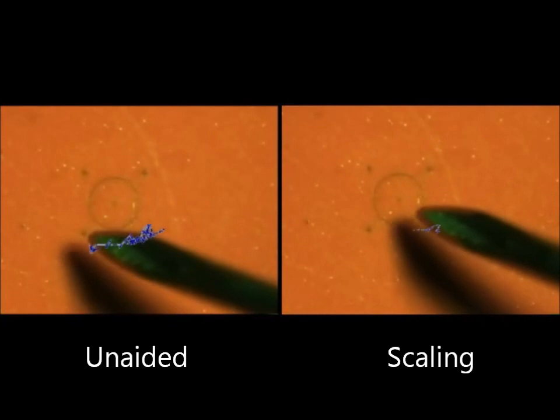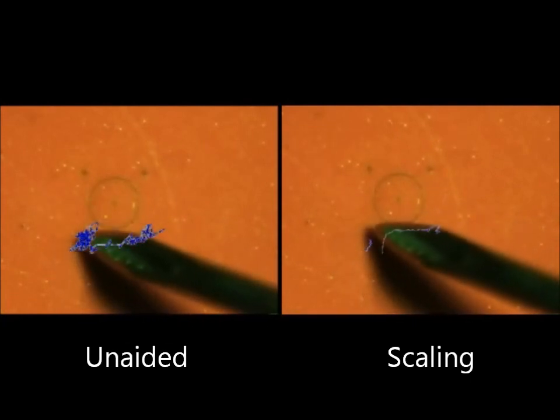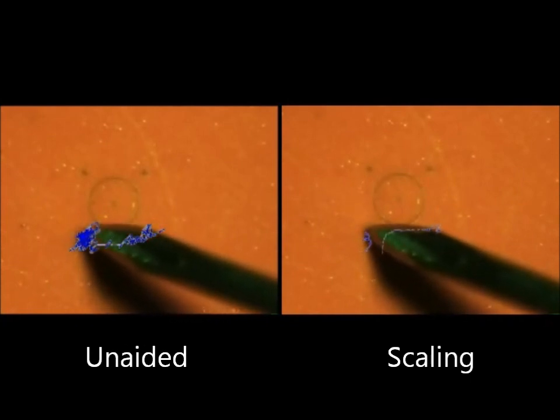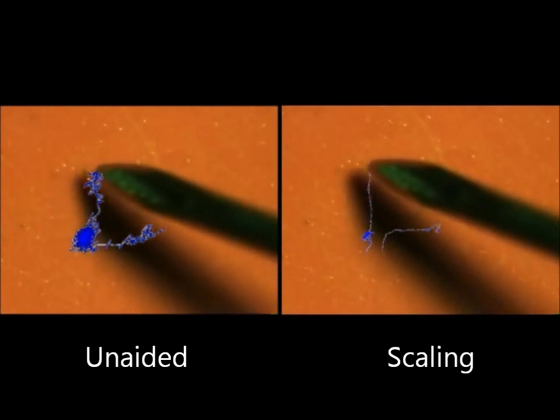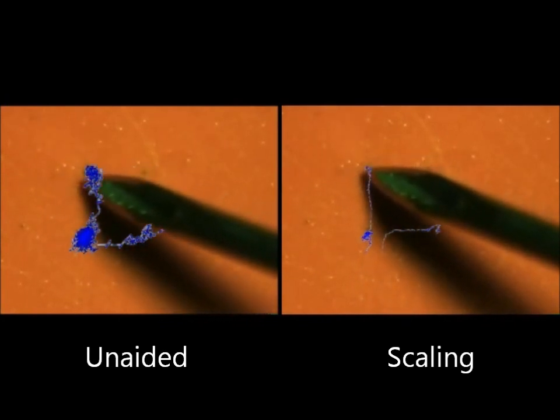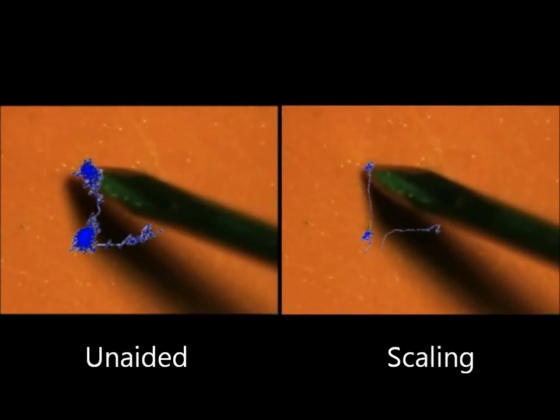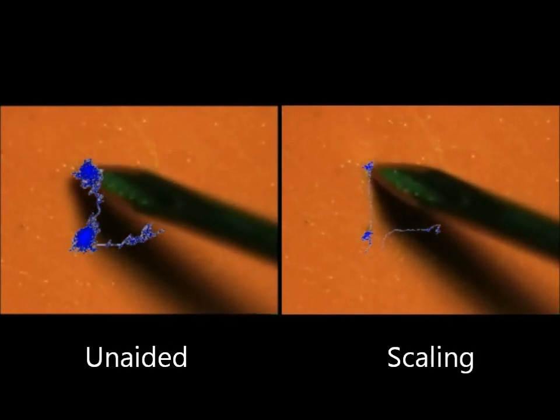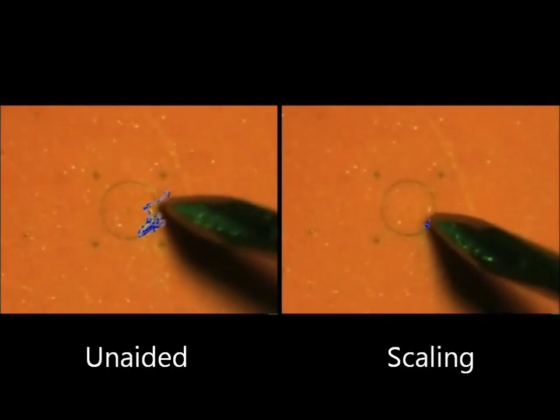In the move and hold task, the tool is held still at one of the crosses for 15 seconds, then moved to the next cross. This resembles common tasks in eye surgery. In the last task, the tool tip is used to trace the outline of the circle.